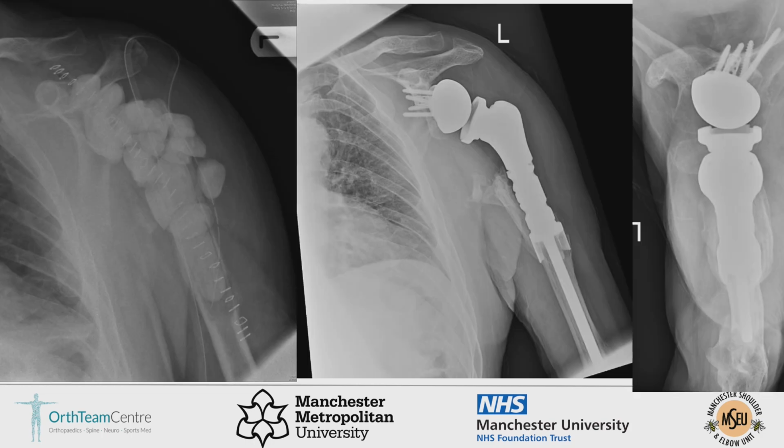This is one I showed earlier. You have to make up your own cement spacers in bone loss. And then he repaired well with a humeral reconstruction prosthesis.